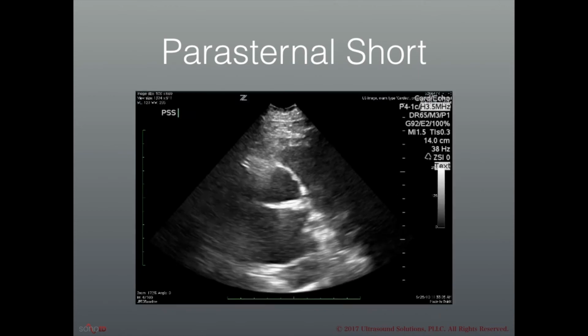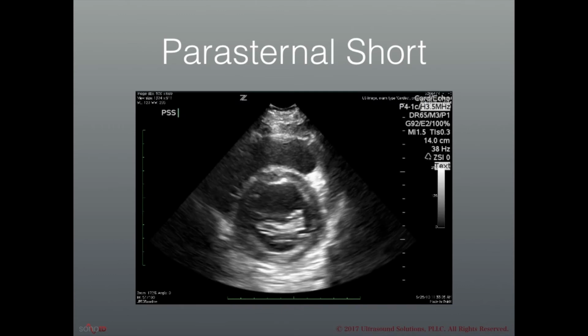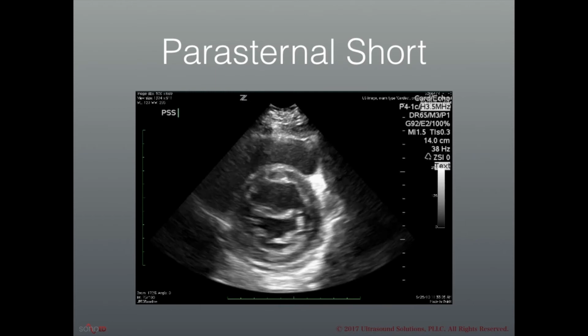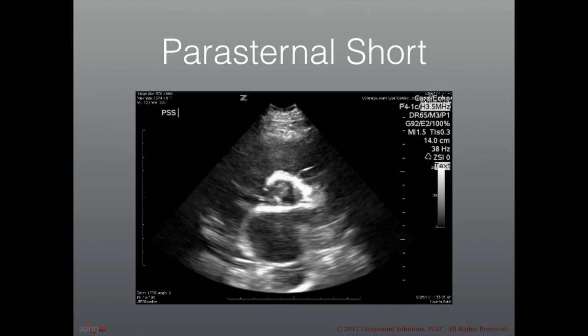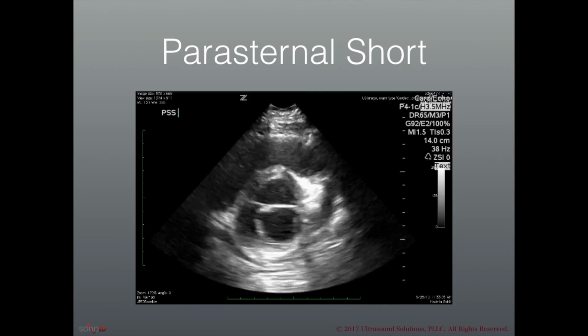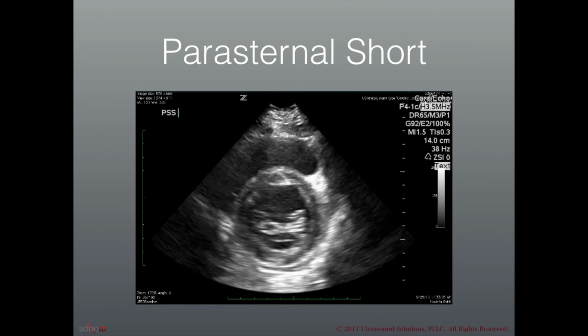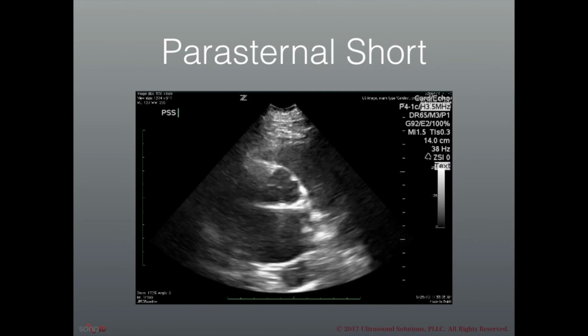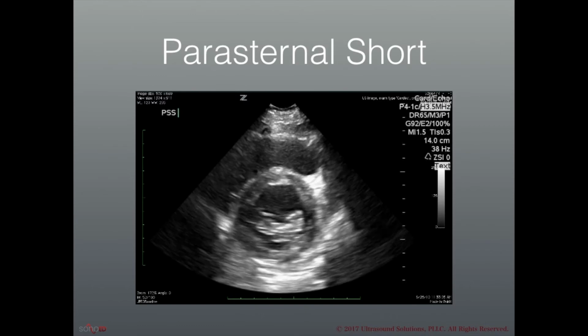The next view I'm going to show you is a view wherein the sonographer moved the probe during the scan. And this is something you generally would not want to do once you've acquired an adequate image because, again, it makes interpretation more challenging. But the reason I include this view is because it allows you to see the different structures of the heart, if you were to start at the base of the heart or higher up and sweep down into the left ventricle.